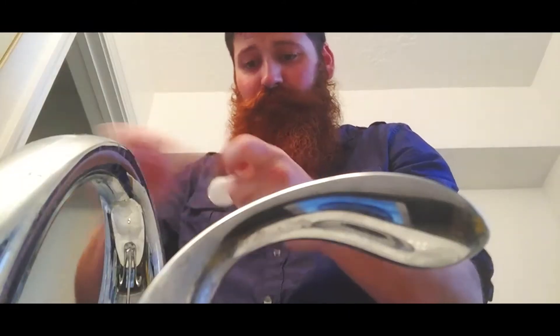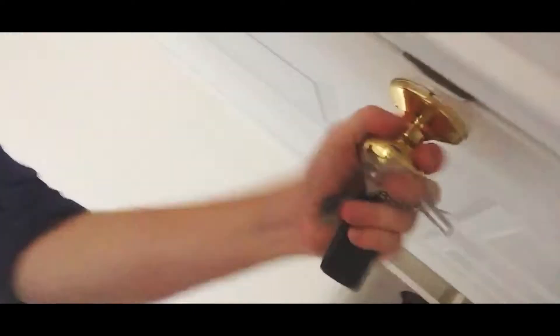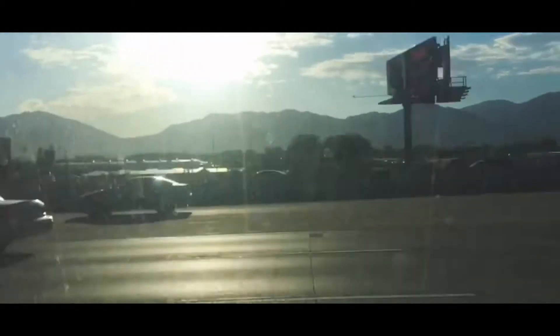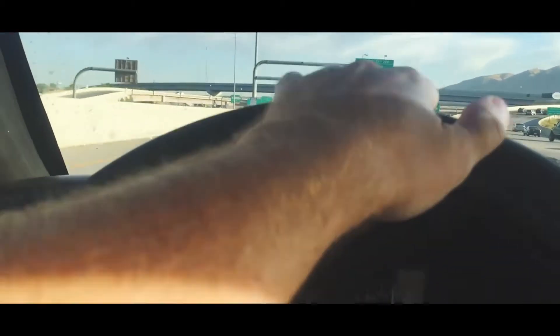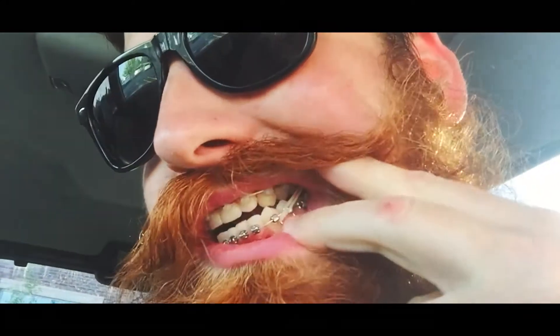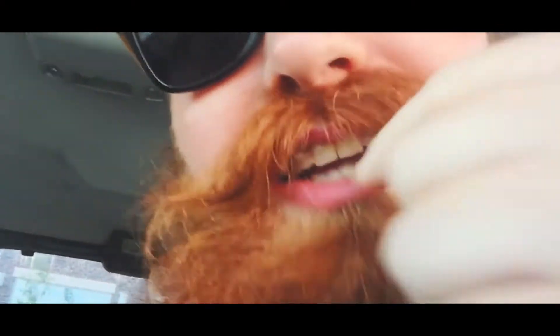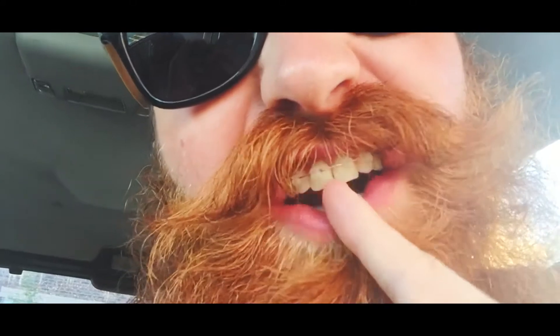Everything's a little bit blurry right now. Just got to the orthodontist and before I go in, I just want to show you what I've got going on in here. We've got the band from right here up to the back there, and one right here up to the back — same on both sides. I got a little bit of a gap in my teeth right here that showed up a few weeks ago.